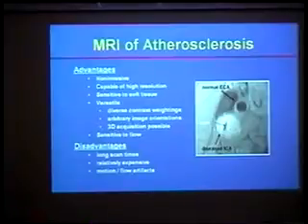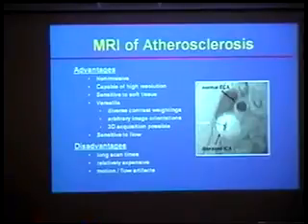If you were to compare MR images versus the other image modalities, why is MR better in this case? First of all, this is completely non-invasive. And it has very good soft tissue sensitivity. Also, if you think about the MR signal, it is sensitive to both stationary tissues, like the brain, and flowing tissues, in this case blood. So you can use MR images to highlight where the blood is, in the so-called techniques of MR angiography.